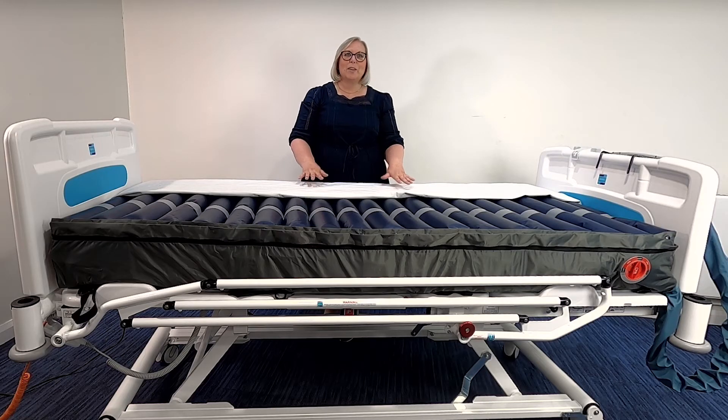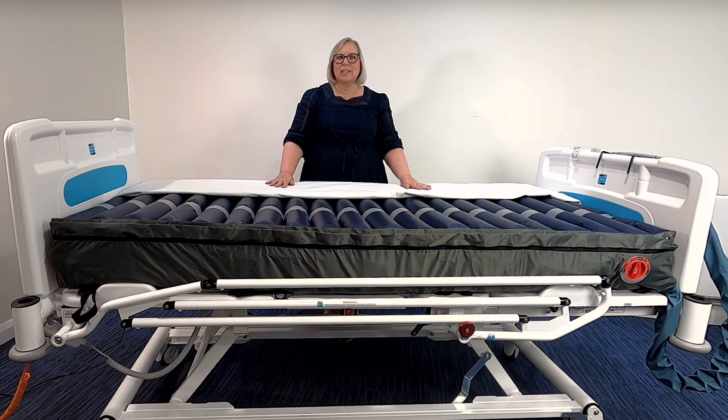So we are now going to look at the mattress in a little bit more detail. The mattress cover itself is multi-stretch, water resistant and vapour permeable. There is also a 360-degree zip which allows for the replacement of the top cover only if it is required. The cover also has high-frequency welded seams and a zip flap, which reduces the possibility of any ingress of fluid and aids with infection control.